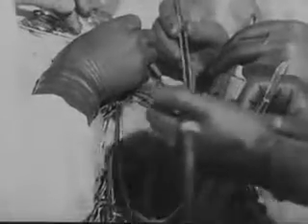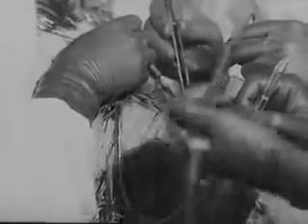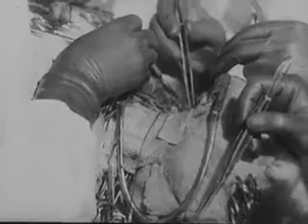Here is a patient being placed in the prone position for a craniotomy. Notice that the anaesthetist does not lose his hold on the tube while the patient is being moved. Also note that endotracheal anesthesia is of the greatest advantage to the surgeon in helping him to maintain strict asepsis.